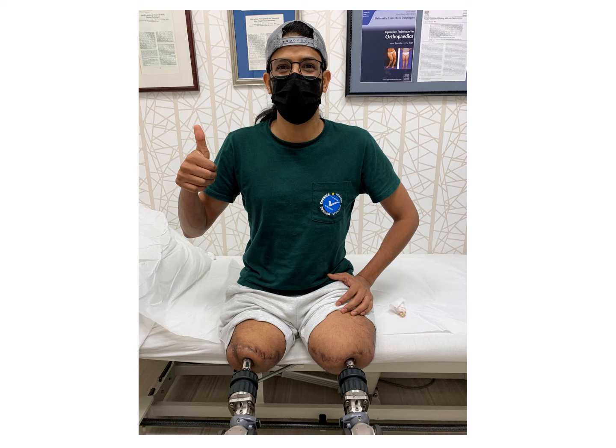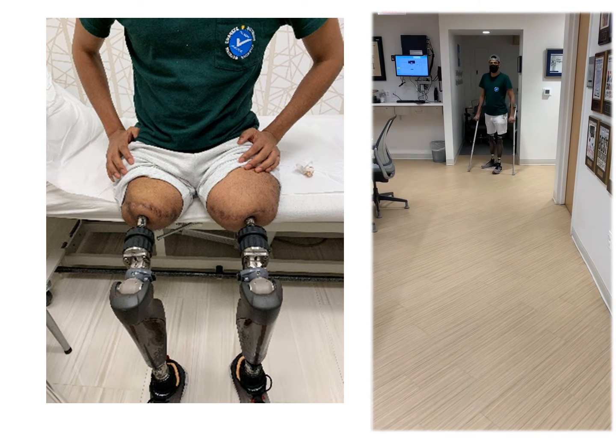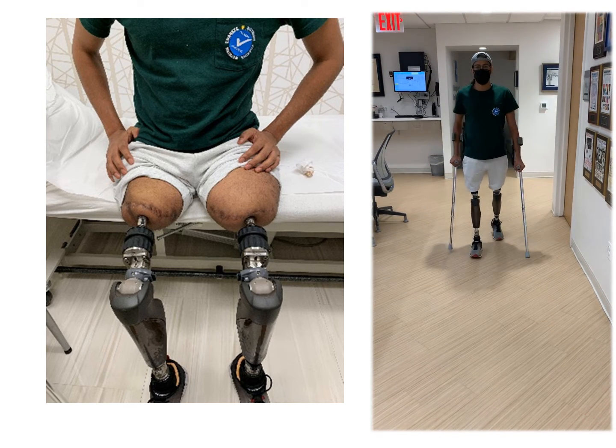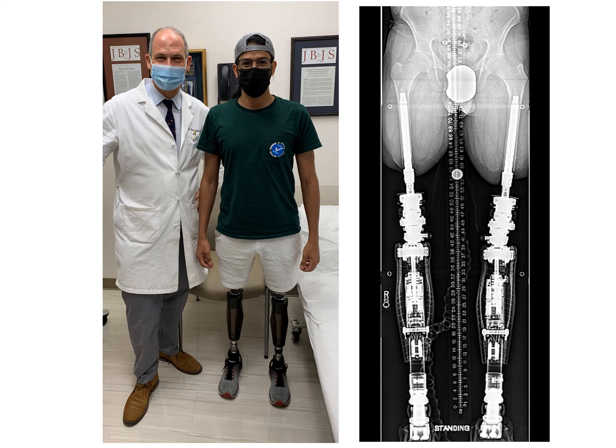This is Thamer expressing his joy with his newfound mobility. He's got quick connects, and here he's pictured at around four and a half months after the surgery, already walking pretty well with Canadian crutches. He's gaining more and more independence, and his confidence and his mental state is dramatically improving.